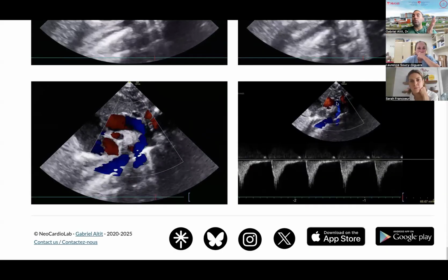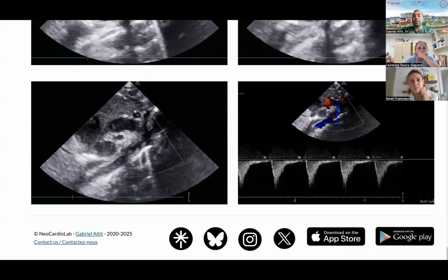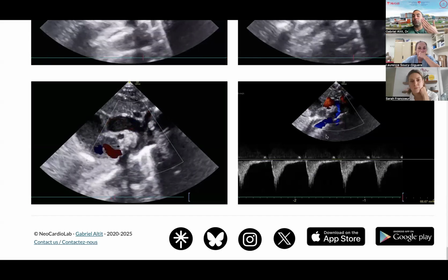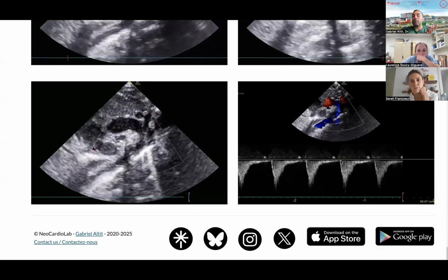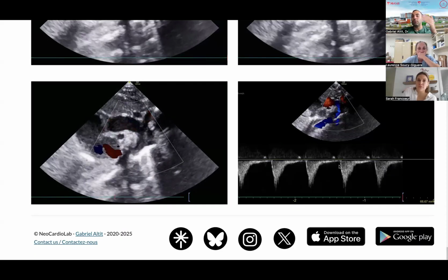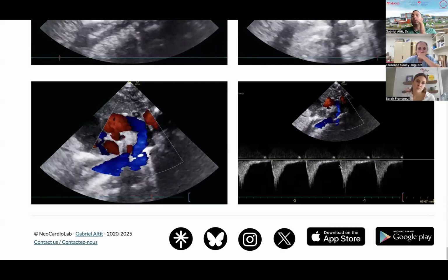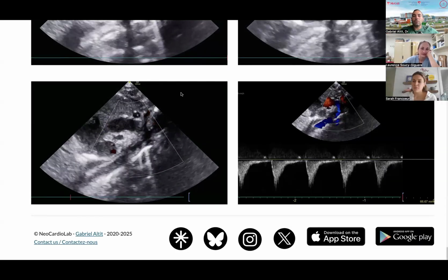And you can do it also if you're looking at aortic flow. So this is like an arch view where we see the ascending aorta, the transverse aorta, the descending aorta, the abdominal aorta. And you can capture, for example, the descending abdominal aorta to get a sense of what's happening in my flows. And that will be particularly important if you want to rule out retrograde flow or steal effect from a duct structure or any other elements that could cause reversal of flow in diastole. Can you name me a few differential diagnoses of reversed diastolic flow?